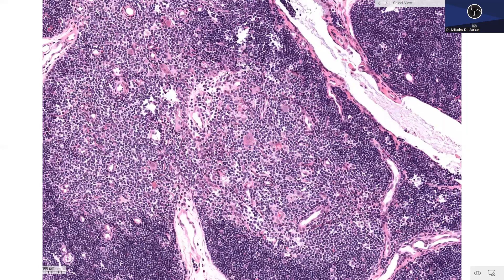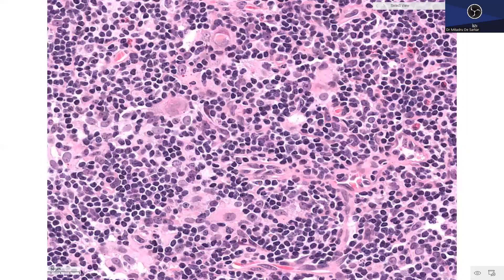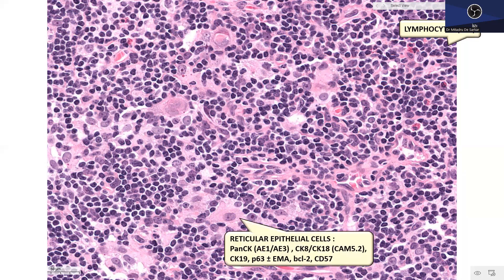Moving towards the medulla, lymphocytes are more spaced apart, giving a pale appearance. You have slightly larger polygonal cells — the thymic reticular epithelial cells — in intimate admixture with the lymphocytes. These polygonal epithelial cells are also seen in the thymic cortex but are more represented in the medulla. The lymphocytes in the medullary background are less crowded than in the cortex.